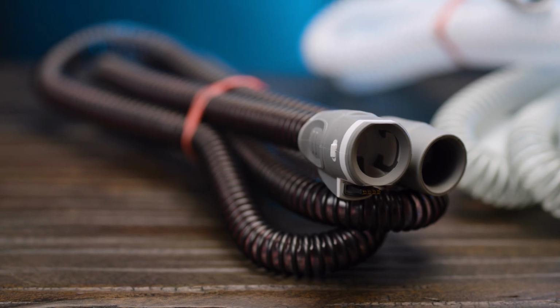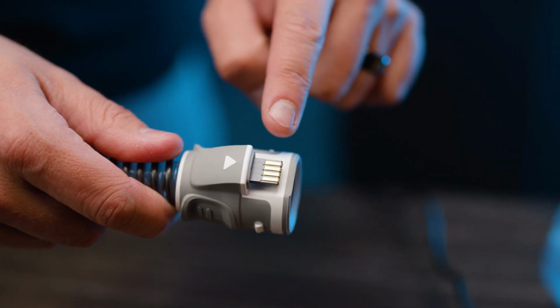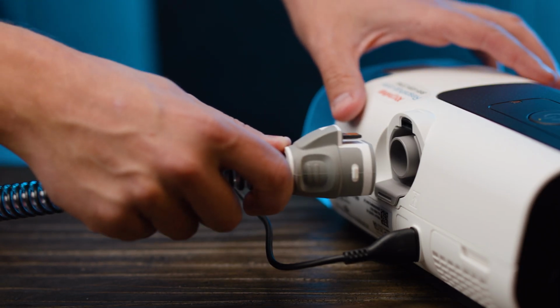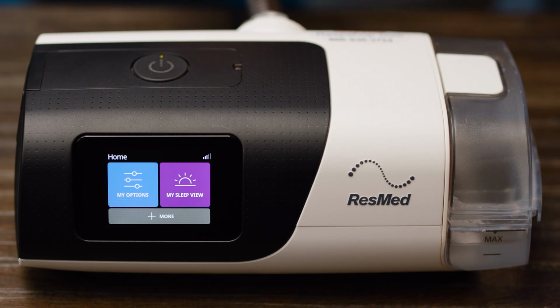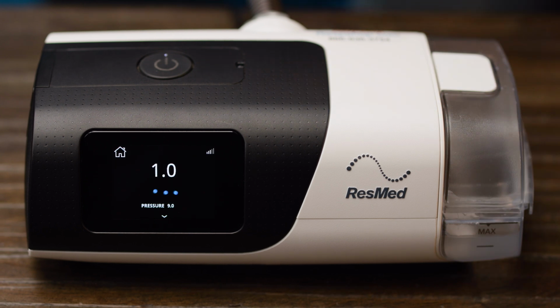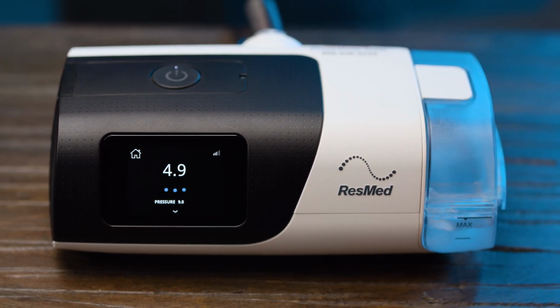But if you do want to use heated tubing, you will need to use the one that matches the brand of the CPAP you are using, because the way the heated tube connects will be unique to that make of machine. In that case, there's no further tubing decisions for you to make, because heated tubing only comes in one size and length for each unit, so get that one. But wait, how can you know whether you want heated tubing when you don't know what it does? Well, here are the pros and cons of heated tubes for those that have the choice.